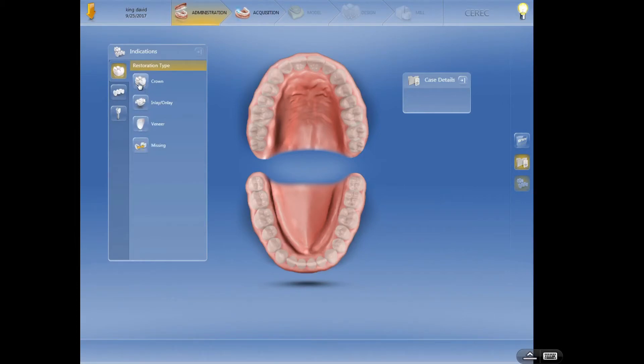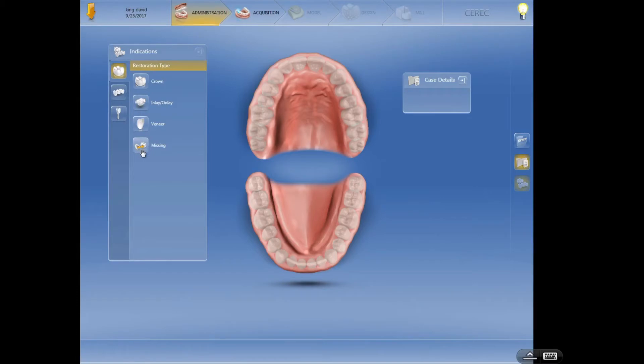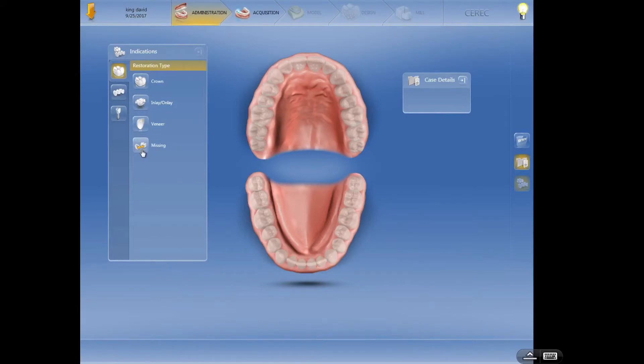Before we do anything, I'm going to jump down to this missing option. You'll notice when I go to the bridge it's still there, but we have to be very careful. This is a tooth that has been extracted or is missing from the arch not because it was extracted, not because it was taken out and replacing it, but because it was taken out for orthodontic reasons.